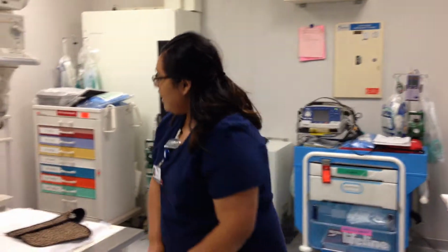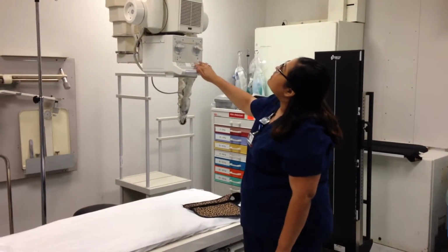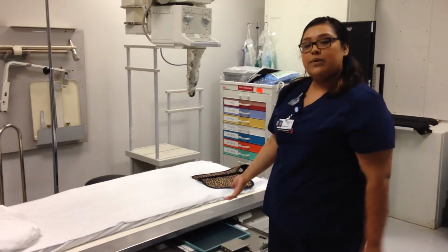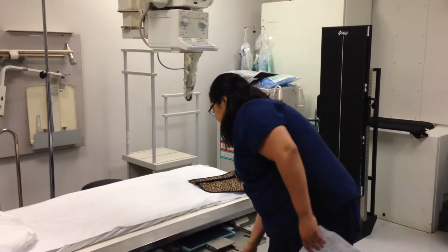So before I get my patient, I just want to set up my room here, and I want my tube detented to the table. We'll be using table bucky today. We'll be detenting like so. It's already on here. And we'll be using the 8x10 or 10x12 for the image, and I've gone with the 10x12 lengthwise.